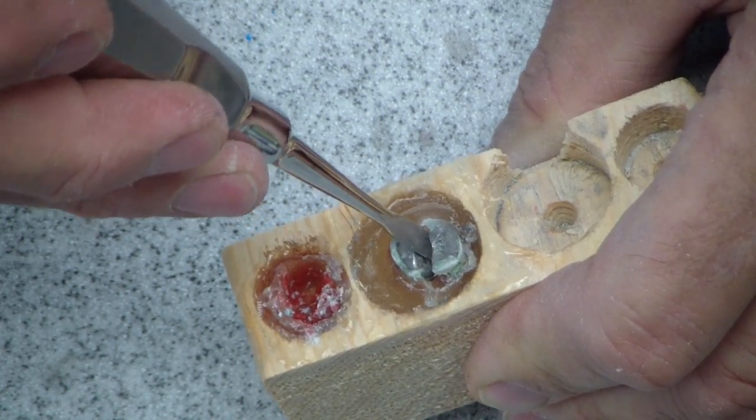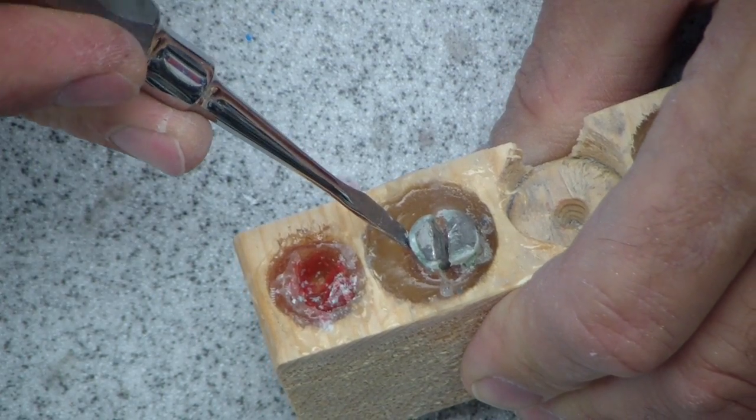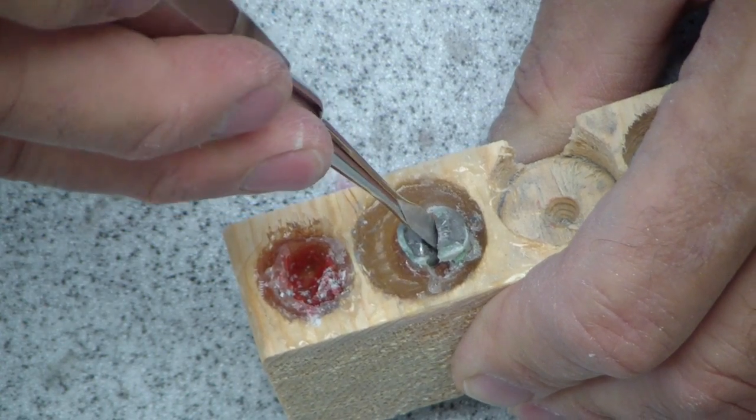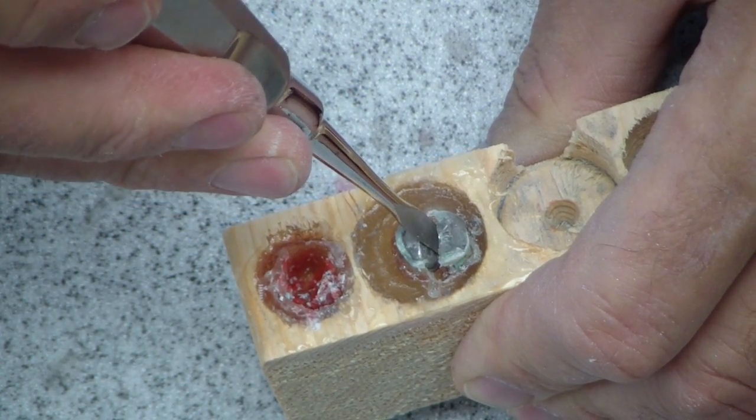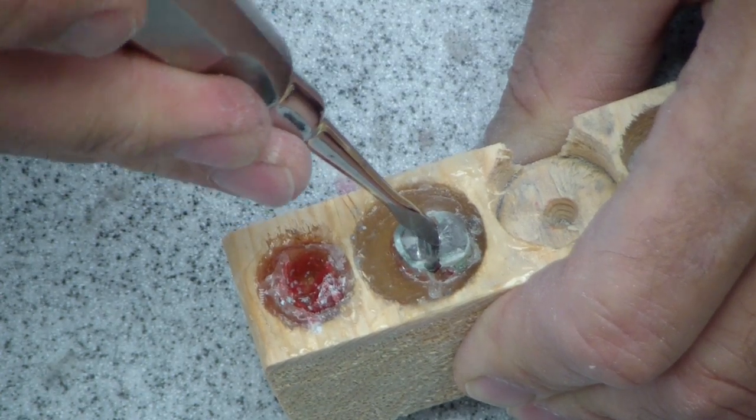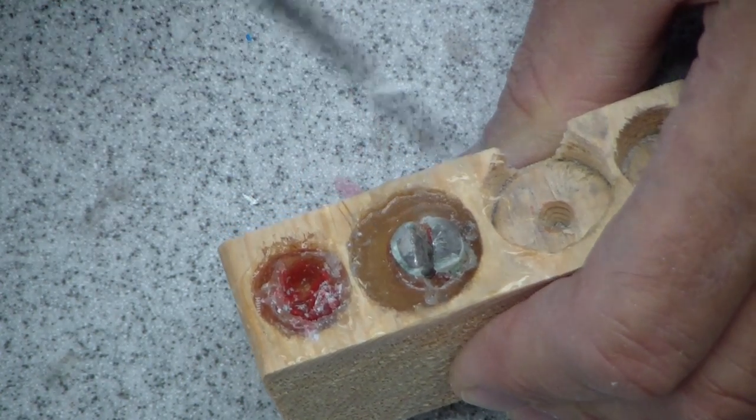Now once you do that, you can kind of expand the alveolus a little bit. And then you can find them on both the mesial and distal surface. You can probably get the elevator back in there and wiggle it a little bit. Again, bone expands slowly. Don't be in a hurry. Just take its time there.